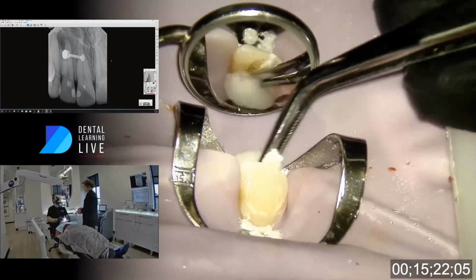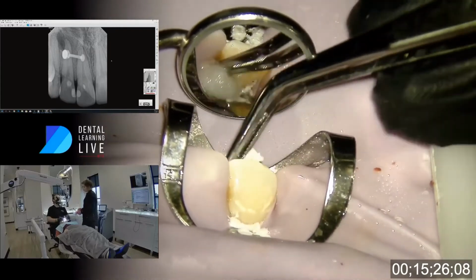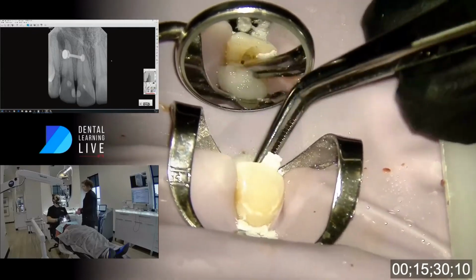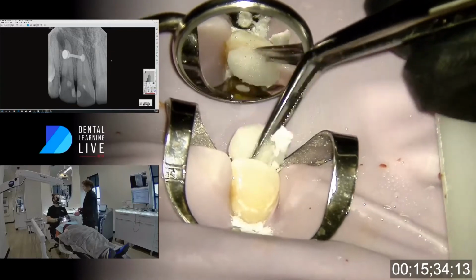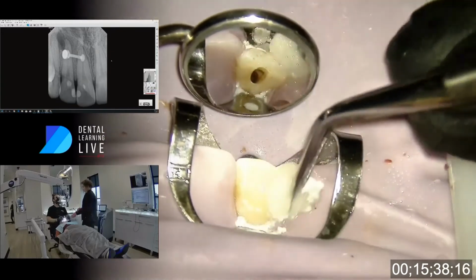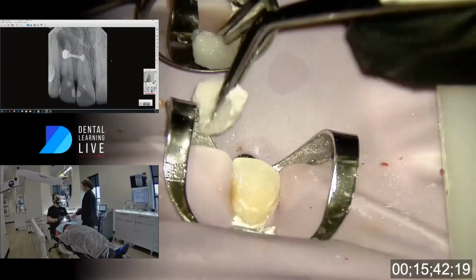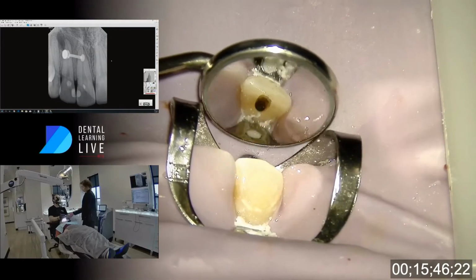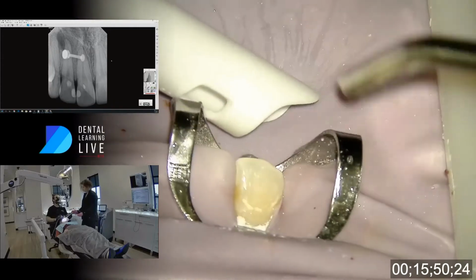1506 kind of went to my working length without even really feeling like it was touching anything. I did pass the 2504 file in and had the same sort of sensation. So this canal is much larger than that. But the instrumentation is really to set the stage for the GentleWave at this point. So the philosophy is a little bit different. The mindset's a little bit different. I'm going to go ahead and dry all this now. And that's just isopropyl alcohol.